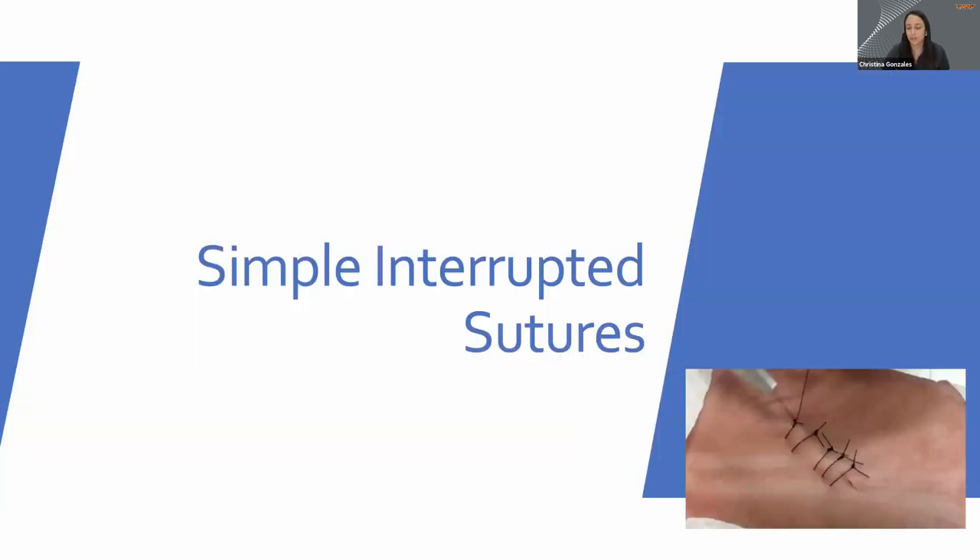First, we're going to talk about simple interrupted. In my practice in emergency medicine, I would say 98% of the time I'm doing simple interrupted sutures. The reason is because they're really easy, simple to put in, and they hold the skin together really well. The majority of what you'll be doing in urgent care or emergency settings are simple interrupted sutures, so if you're going to spend a lot of time practicing, definitely practice this one the most.